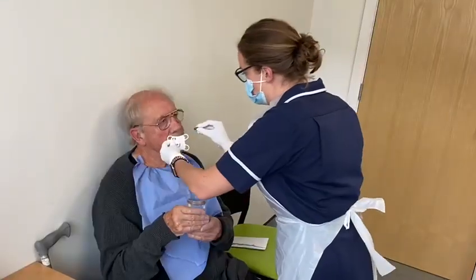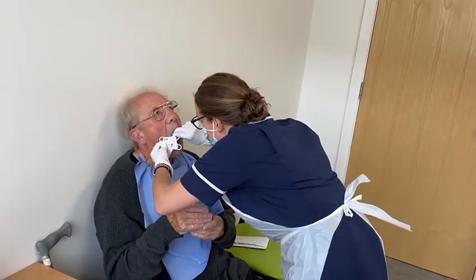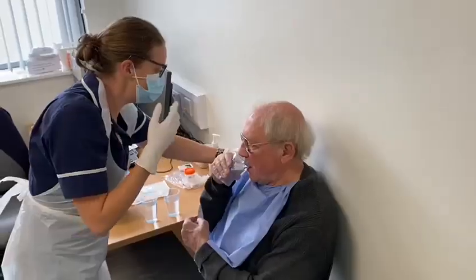This is the little device — it's just a little capsule that looks like a standard tablet. We attach the string next to the pill, pop that into the throat, and then get the patient to swallow water to swallow the capsule and string down.